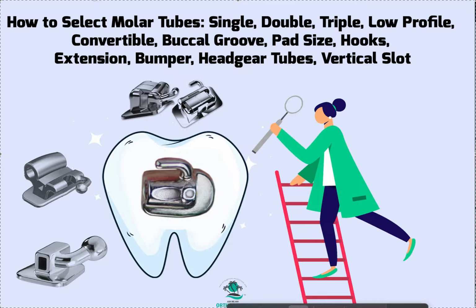Well, you probably wouldn't be if you're using indirect bonding, because those are actually included. The only reason you'd be ordering molar tubes is if you've graduated from indirect bonding to direct bonding and you're deciding to freehand it. I never recommend that people start with just direct bonding.